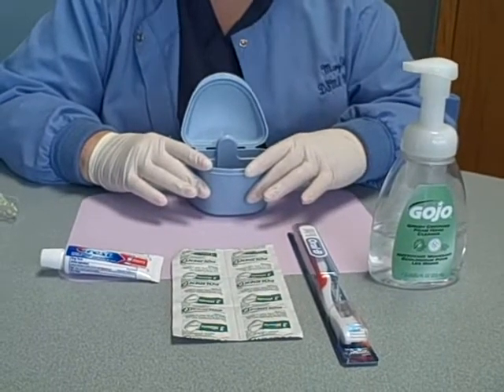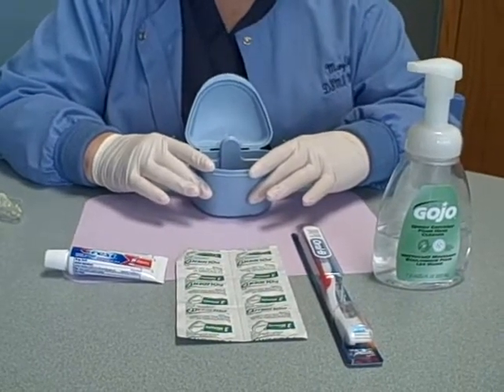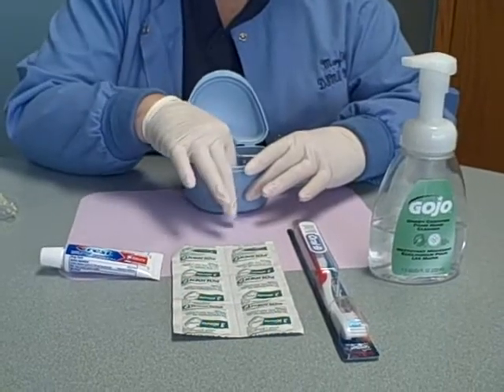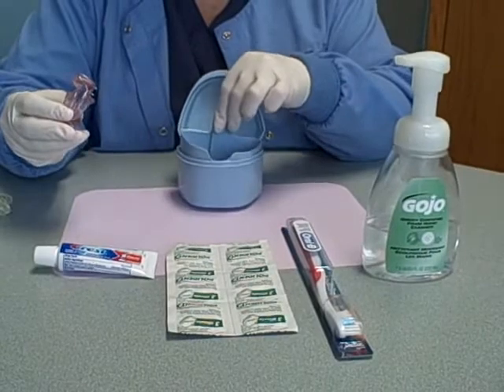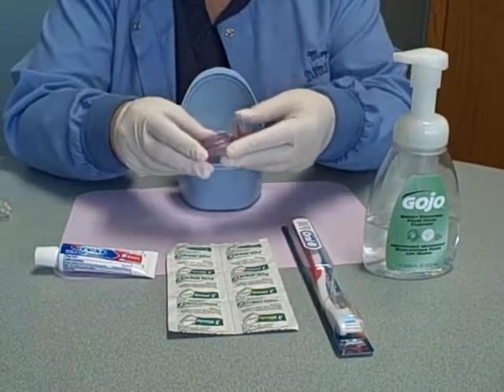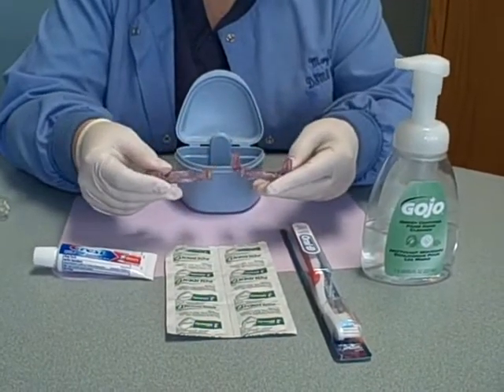Today I'm going to show you how to properly cleanse your Somnomed oral device. This is the box that it comes in or something quite like it. This is your Somnomed oral appliance.